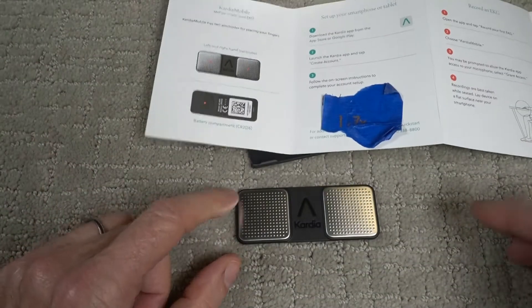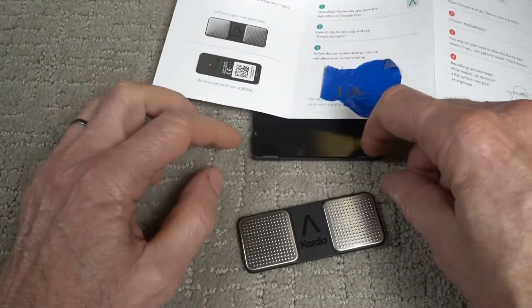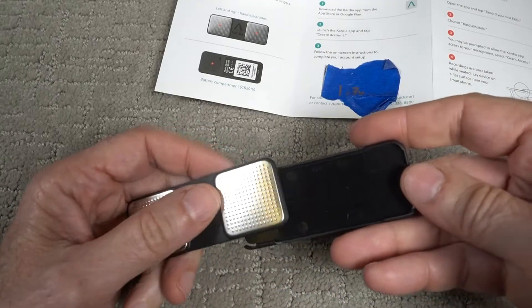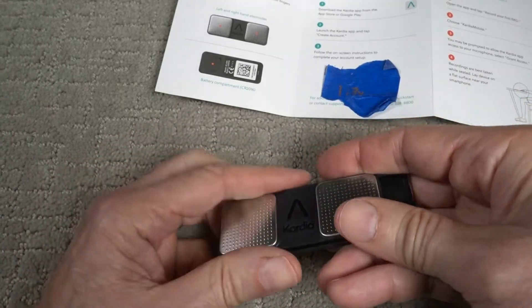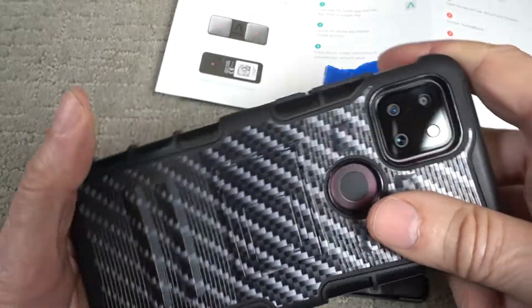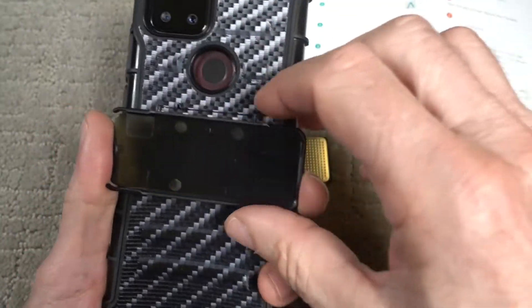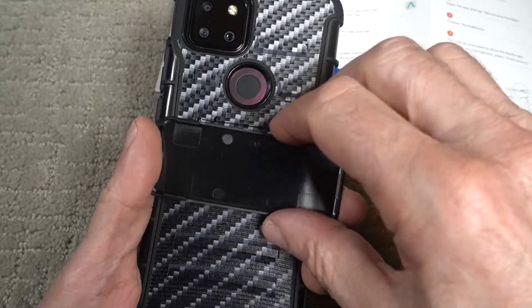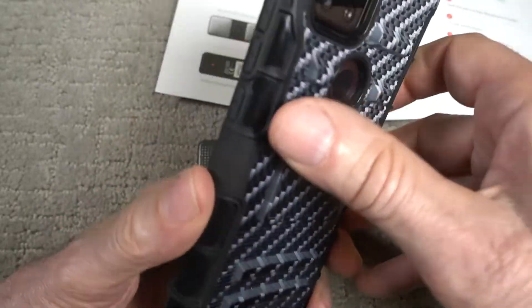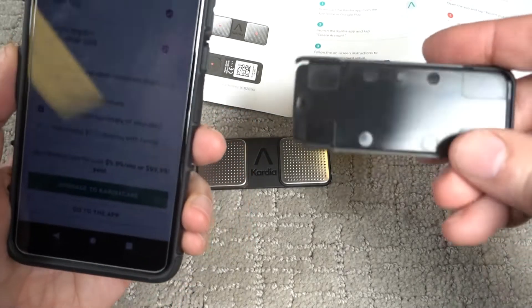There are two electrodes on here for placing your fingers for a reading. Battery compartment is on the back. Then there's this holding device which has sticky tape on the back, and this snaps in there. They recommend that you put it on the back of your phone. Since I have this case on the back of my phone, I really don't have a good place to stick this thing — or do I? No, it's kind of awkward; it's got all these ridges on here. Just did a review of this nice case — it's one of my videos out there. I guess I could just keep this in my pocket.